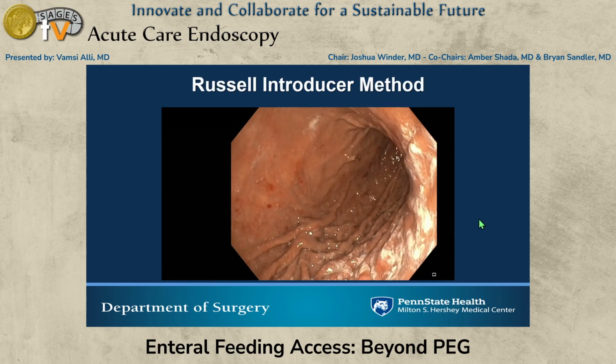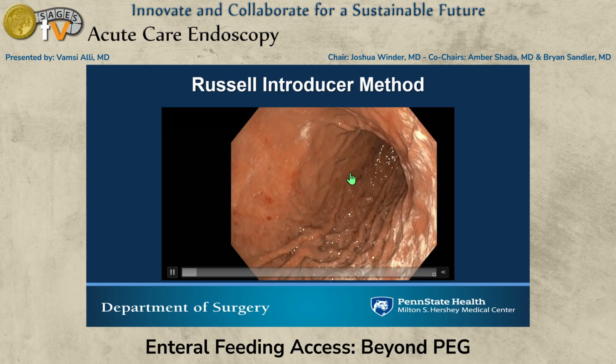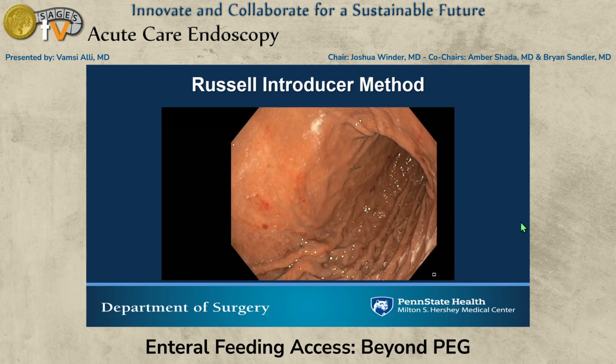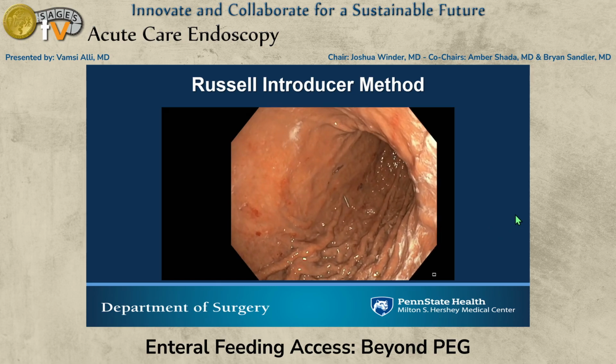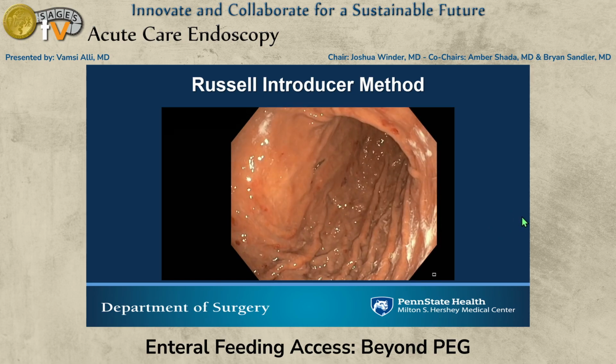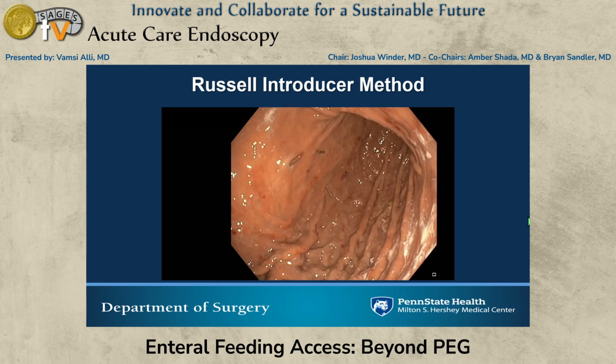So we can watch this. There's going to be placement of the T-anchors, as we talked about. That's what they looked like intraluminally as you deploy them. You generally place 3 of them to provide stabilization and try to puncture towards the center of that triangle.